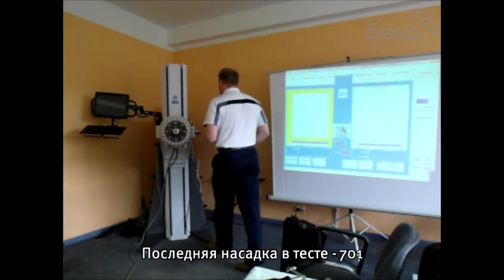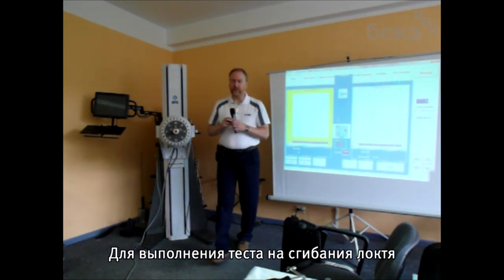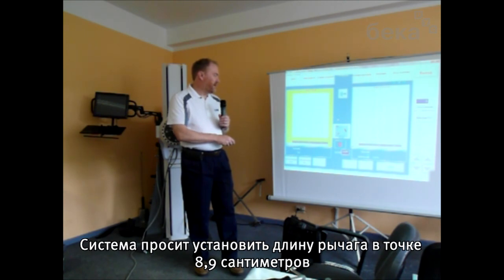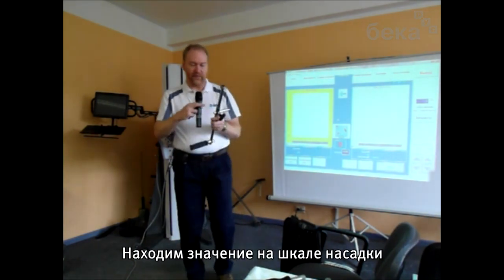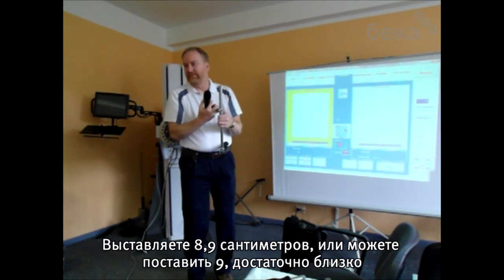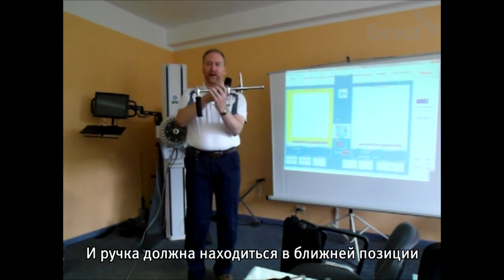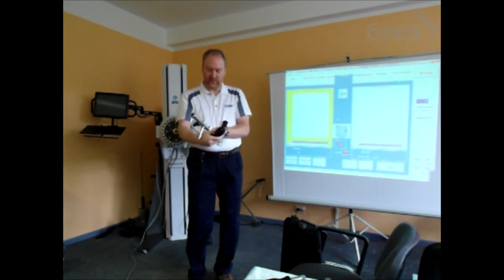The last tool on the list is 701. Is for doing an elbow flexion test. It tells you to set the lever length to 8.9 centimeters, and that's referring to the scale that's printed on the tool. So you just adjust that so it's at 8.9, or you can just set it to 9. Close enough. And the positioning of the handle should be in the closer position, the B position. Actually, that's the A position.